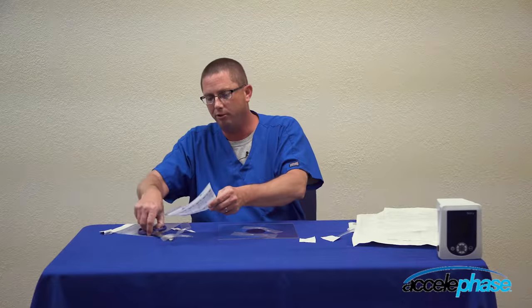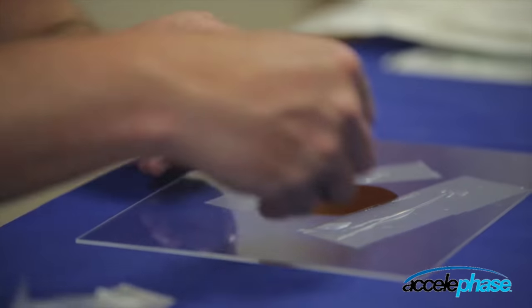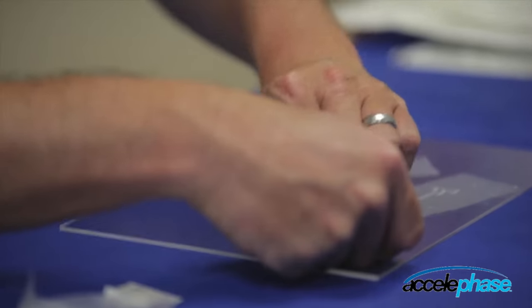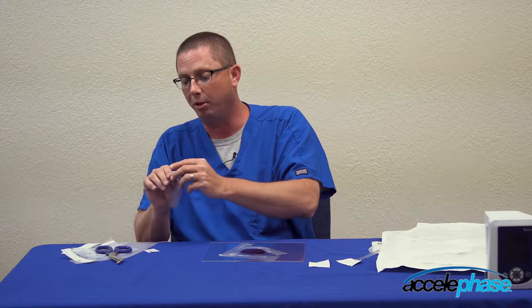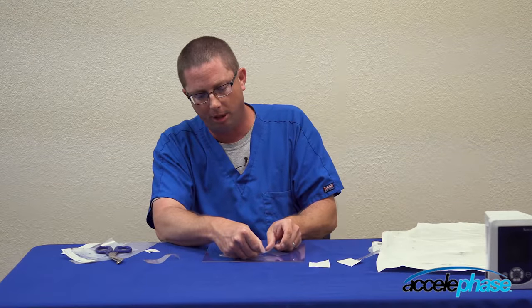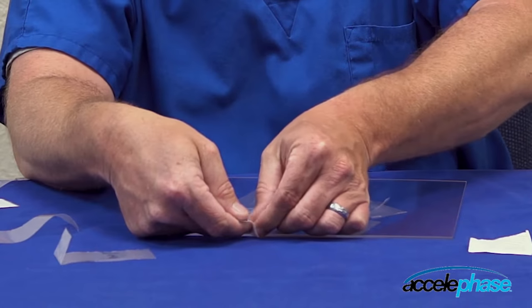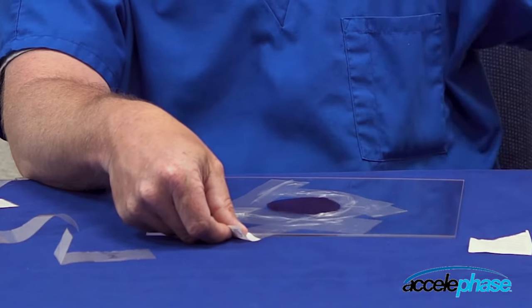I need about two more pieces for this. This is the last piece I'm cutting for the windowpane around the wound. I'm going to line this up, go around the wound margins, remove number two, remove number three.